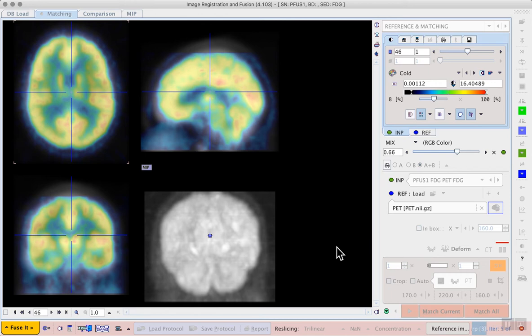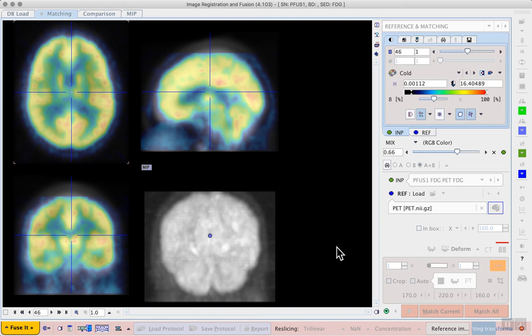For a simple case like this it should proceed rather quickly but the exact amount of time this takes will depend on the resolution of your template image, how similar the two datasets are, and the power of your computer.